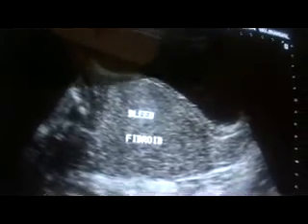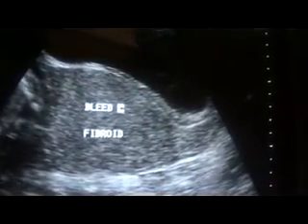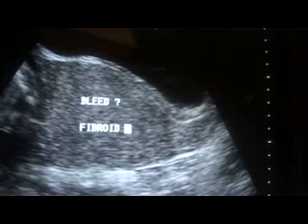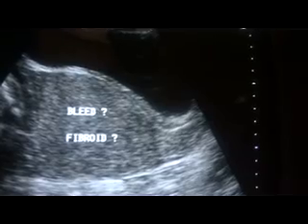Now it appears to me in this section that it relates to the posterior wall of the cervix and measures 6.8 into 4.4 centimeters, whereas I consider this area to be elevated by this evenly echogenic solid area. Now this is the anterior part of the cervix, which is elevated by this solid, evenly echogenic, well demarcated area.